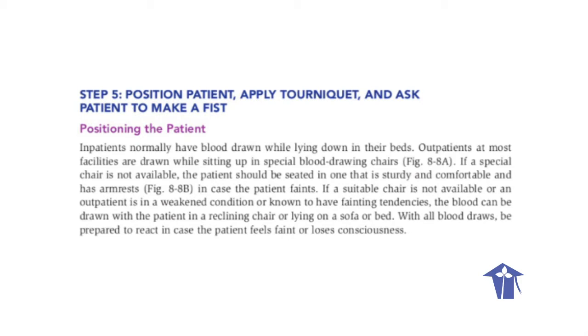Positioning the patient. Inpatients normally have blood drawn while lying down in their beds. Outpatients at most facilities are drawn while sitting up in special blood drawing chairs. If a special chair is not available, the patient should be seated in one that is sturdy and comfortable and has armrests, in case the patient faints.